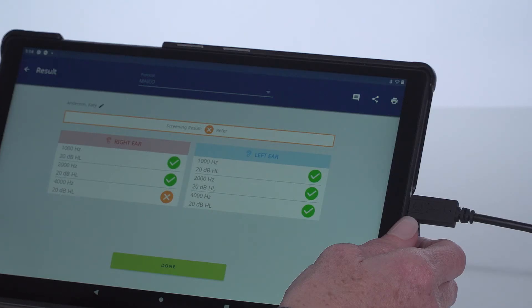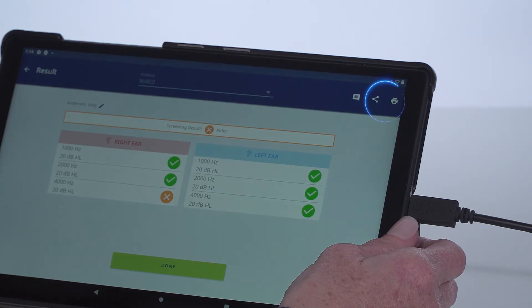The results page can easily be shared via email or printed to a network printer through the icon selection at the top of the screen.